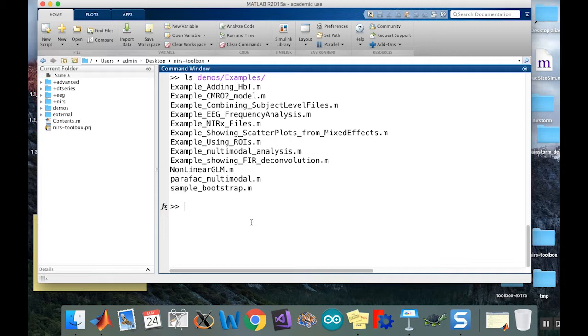And so I'm like, okay, fine, here's the demo for it. So they're fairly detailed in their naming, but it's kind of one very specific thing that we're trying to show. A lot of these don't actually come with data. They just show the lines of code that you would need to do that. So a lot of these don't actually work in terms of you hit go and it's going to complain that data not found or something like that. It wasn't intended to actually be run. It was intended to kind of show people how to do things.